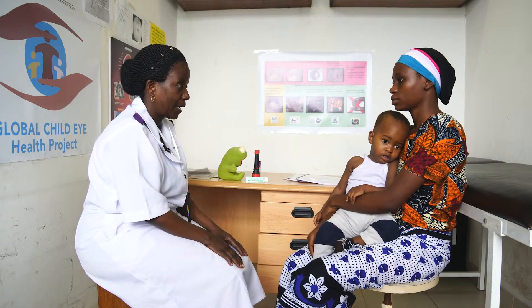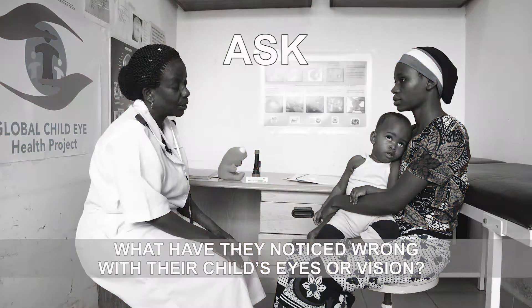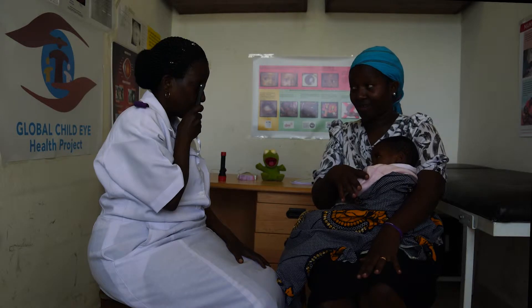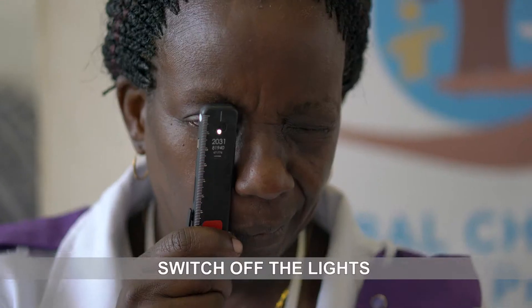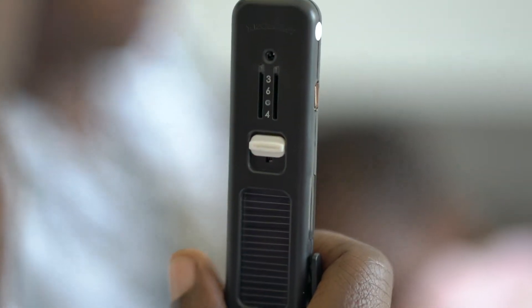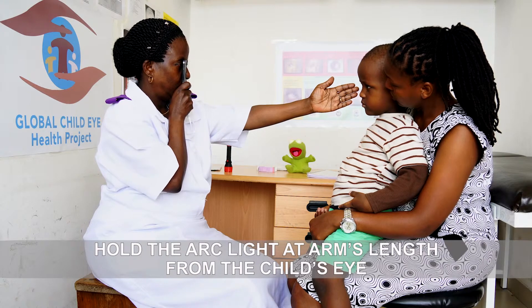First, speak to the mother or caregiver and ask what they have wrong with their child's eyes or vision. Try and do the examination in a dark room, so switch off the lights and cover the window. Hold the arc light at arm's length from the baby or child's eye.